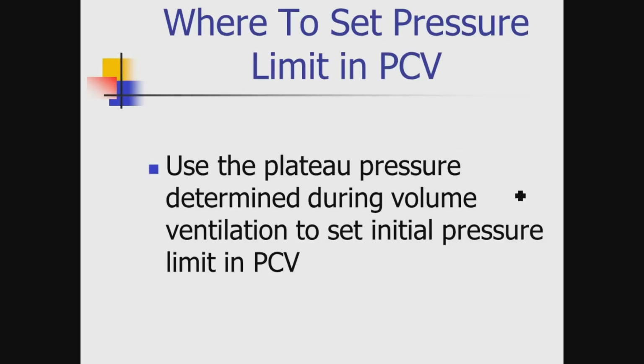Is that still true? Looking at plateau pressure to set the... Yeah. If you're in volume-based ventilation to start with, and you measure the plateau pressure as 25, it's an argument to start your peak inspiratory pressure at 25. Okay, it's what a lot of places will end up doing.